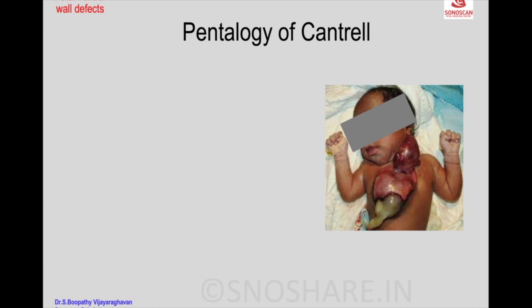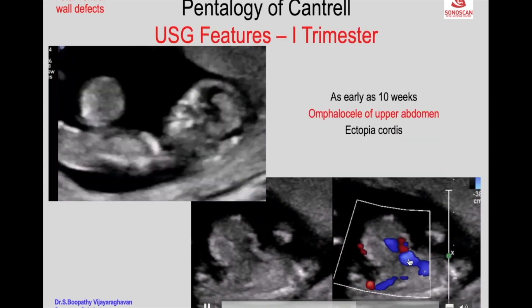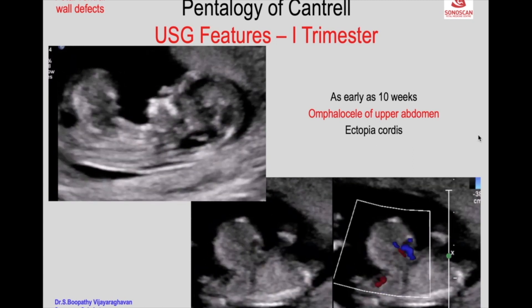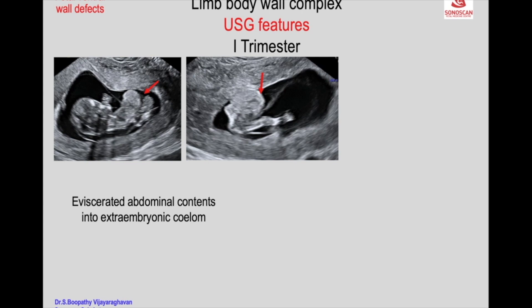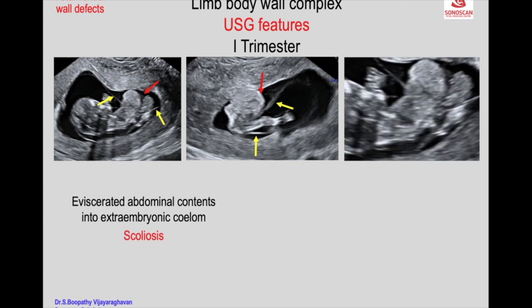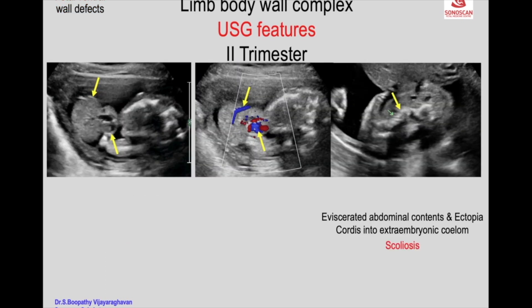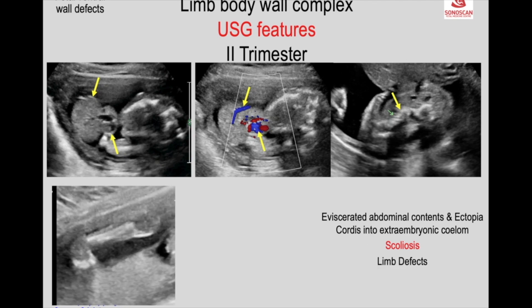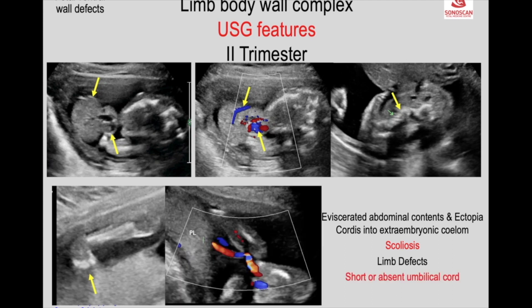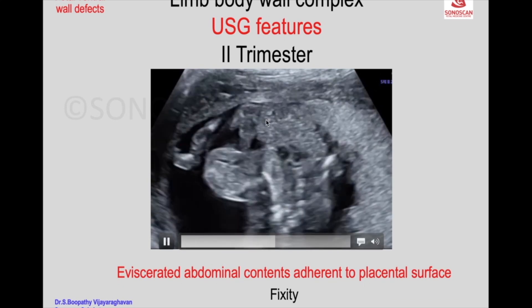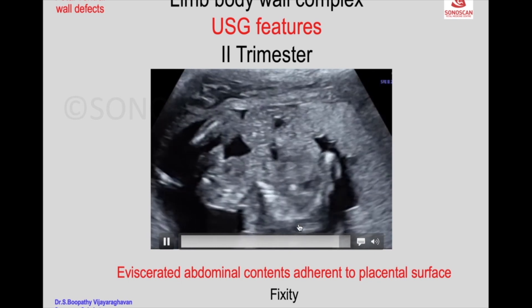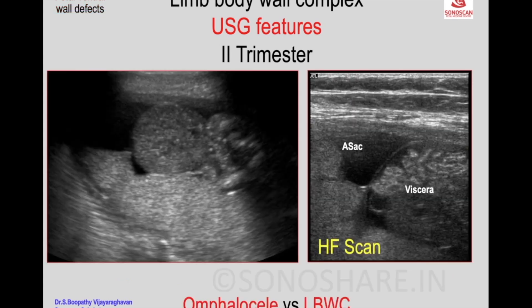Pentalogy of Cantrell shows omphalocele and ectopic heart, confirmed on both grayscale and color Doppler. The bowel herniates outside the amniotic sac into the extraembryonic coelom. You also see scoliosis of the spine, limb defects, and an amniotic membrane. The cord is very short and the eviscerated contents are fixed while the rest of the fetus moves — this fixity is the crucial differentiating feature.